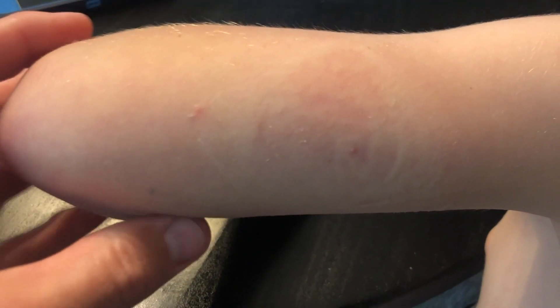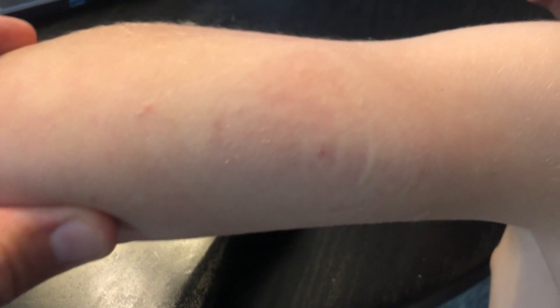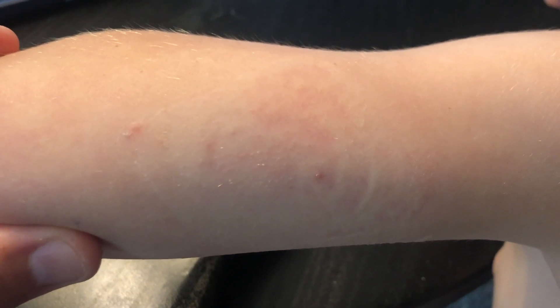Here you can see where I removed the bandage — you can see the diamond shape where the bandage was and the point where the lead was inserted. There's a little bit of redness, but nothing compared to the really bad, red, weeping rashes he would get before we started using the HydroSeal.